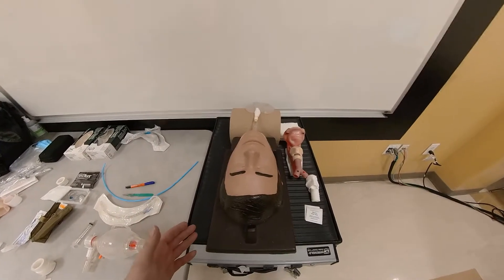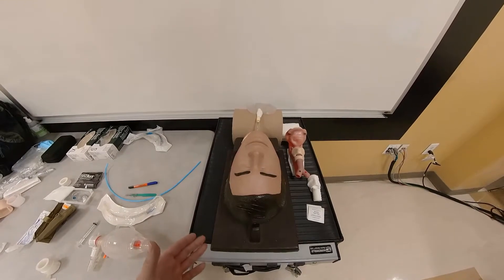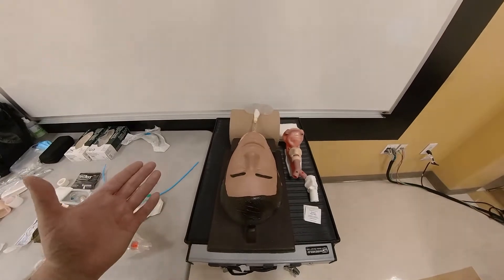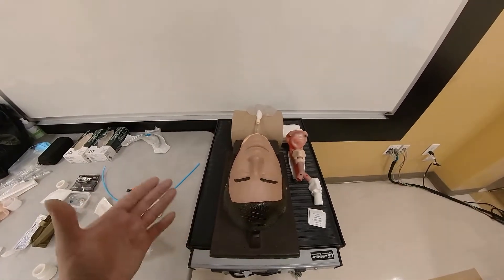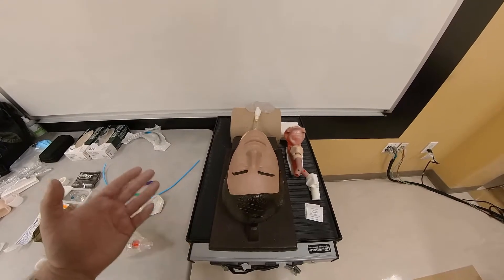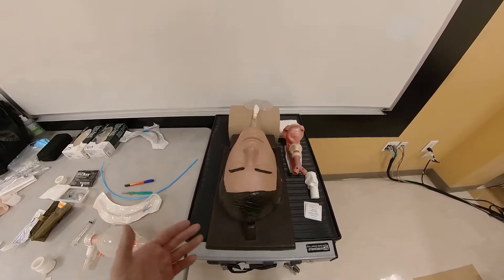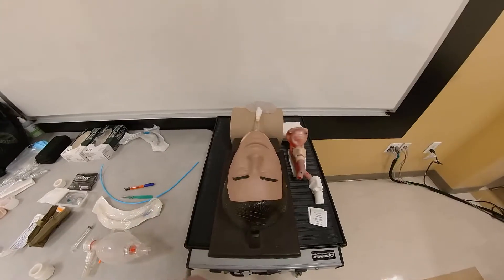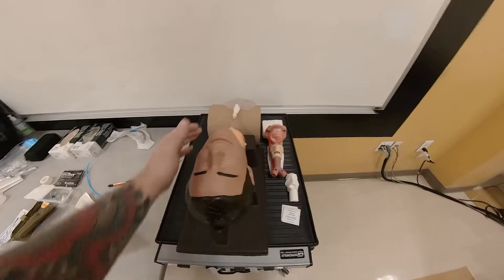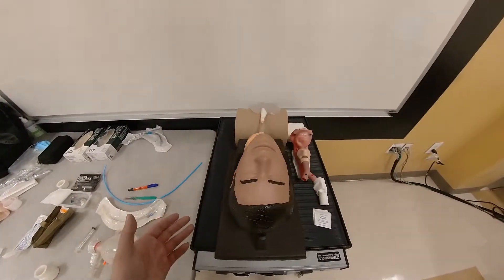The indications of this procedure are as follows: if you have a failure to ventilate the patient, or you have a failure to intubate the patient. If your institution has a protocol or an algorithm, it may look as follows: three attempts of intubation. If they fail, you may try a supraglottic airway, and if you still cannot ventilate the patient, you're going to go ahead and proceed to a surgical airway procedure, which in this case would be a surgical cricothyrotomy.